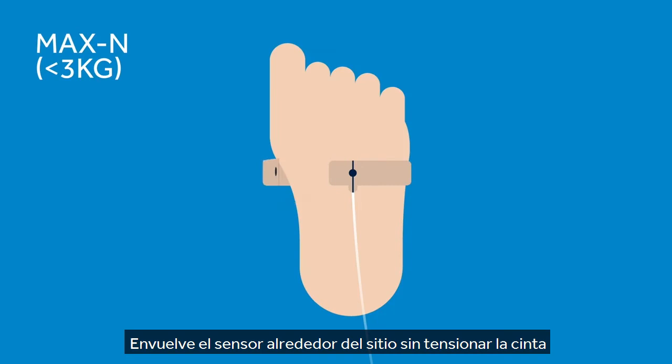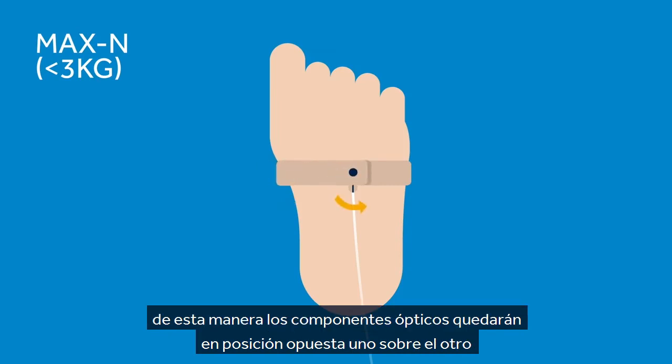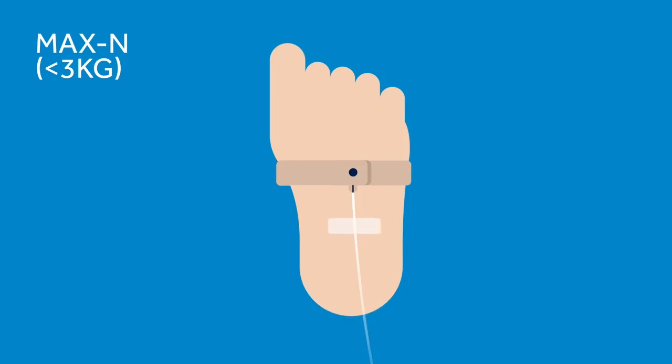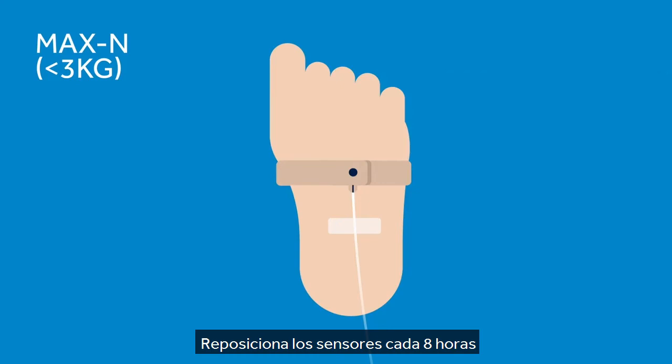Wrap the sensor around the site without stretching the tape, so the optical components directly oppose each other. Anchor the cable with a piece of medical-grade tape. Resight sensor every 8 hours.